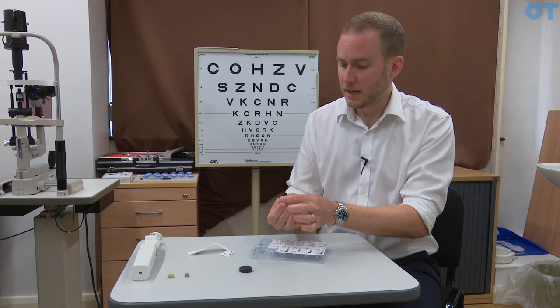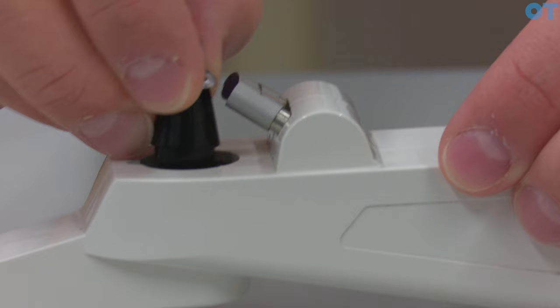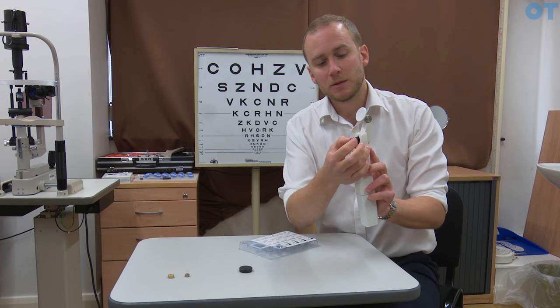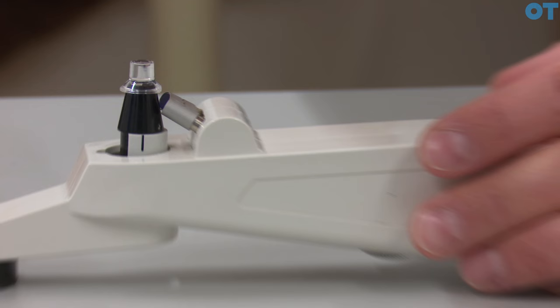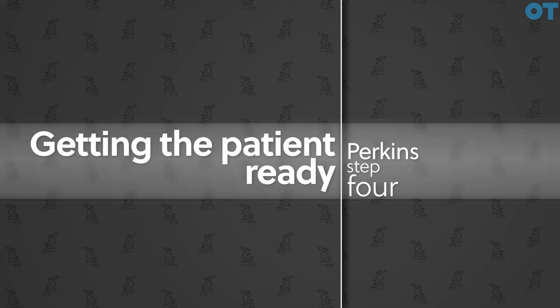These are all in a sterile compartment and we simply align the black probe with the tip and we can remove that without touching the probe. When we insert the probe we need to make sure that it goes into the collar and is pushed right up against it — there should be no gap between the shoulder of the black probe and the collar of the instrument.